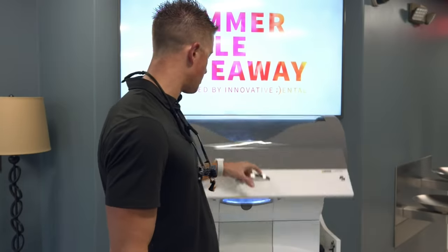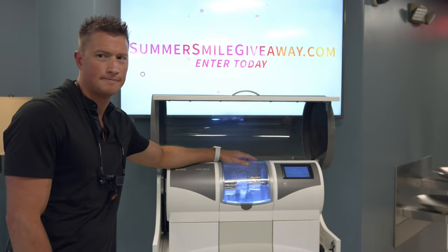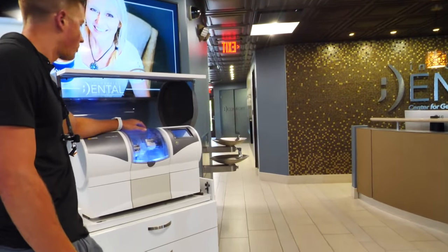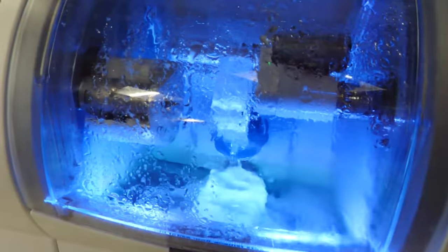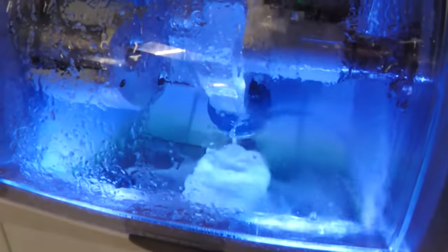I don't know if you can see here, Michael. We can maybe see the pile of snow that's building. All those shavings there at the bottom are from the carbide burrs going back and forth throughout this plastic block, cutting it out. And it's almost done cutting it.